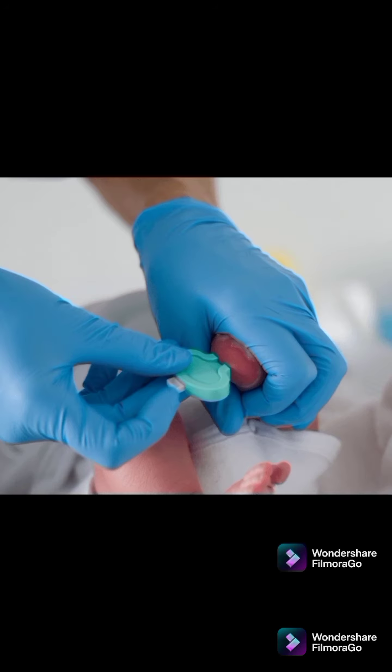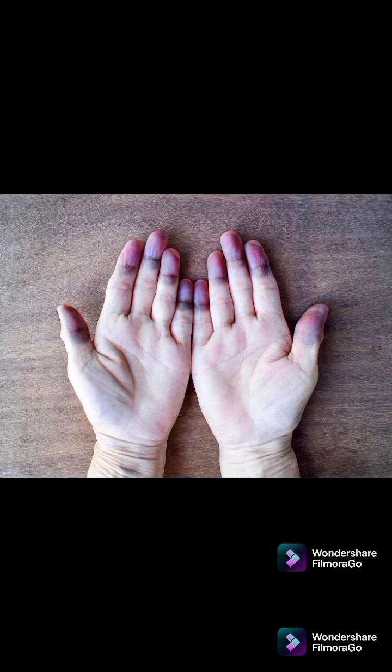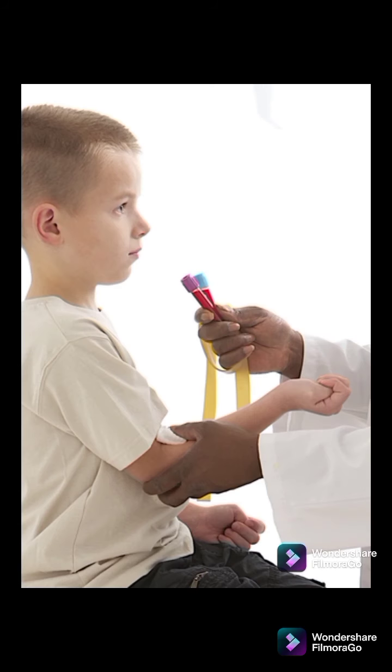Lower finger or heel to encourage blood flow. Wipe away the first drop of blood because it's typically contaminated with excess tissue fluid. Never milk or squeeze the site. Fill tubes in order of draw using micro tubes.